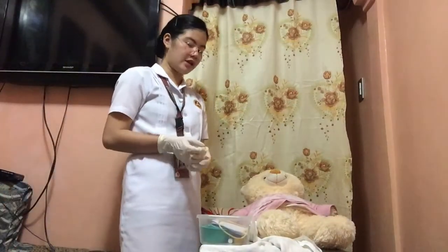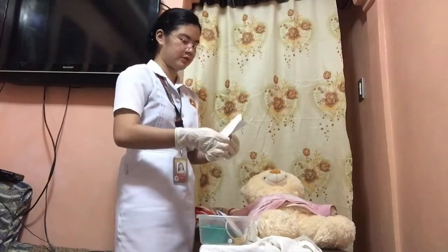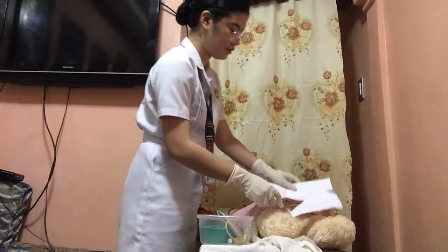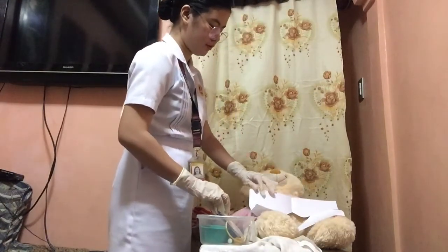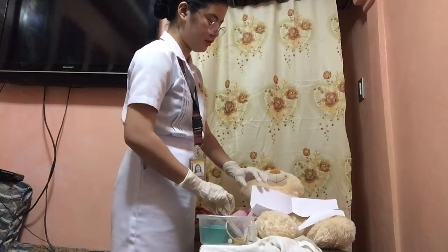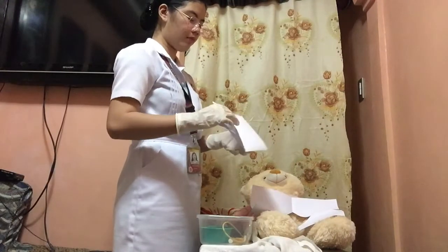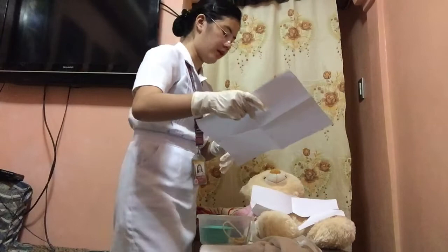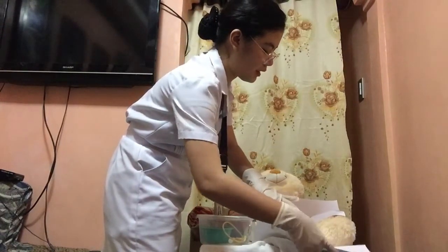And then next, place the fenestrated sterile drape over the perineal area. And then place the drape above the patient's thigh.